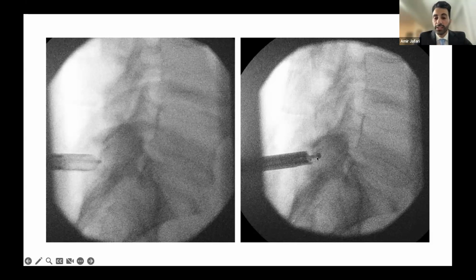A lot of neurosurgeons that do this don't even drill that much. But we get very complicated patients who have medial fragments, a lot of loose fragments. So we drill a little bit to create a better opening so we can maneuver our working tube better and catch all these fragments. Because when these fragments sit there over the years, they become inflammatory and they'll come back with more pain.